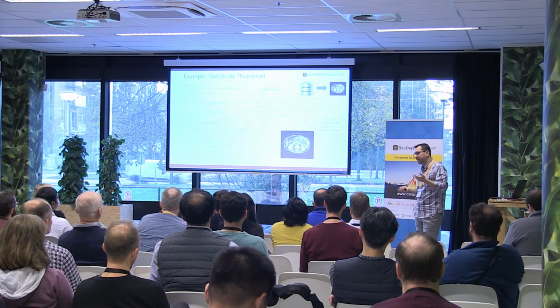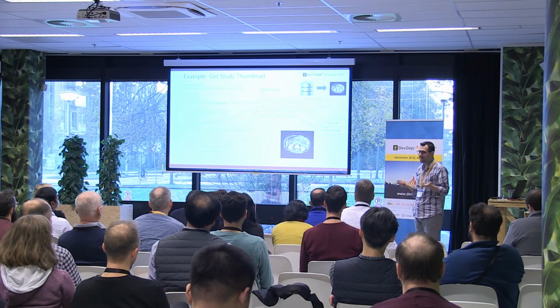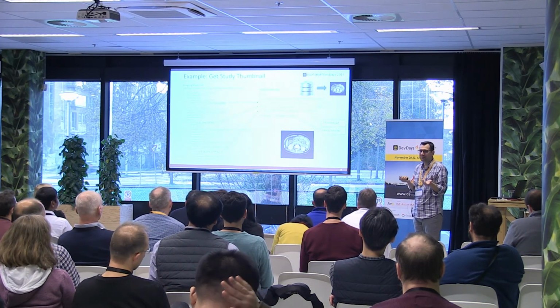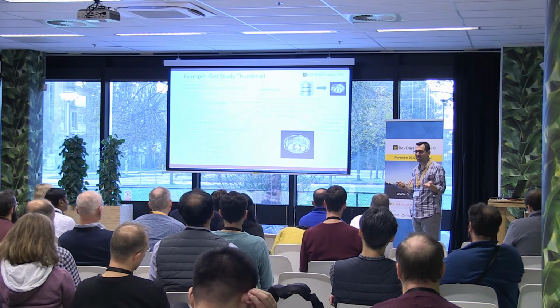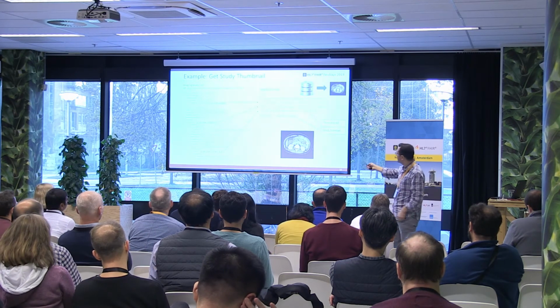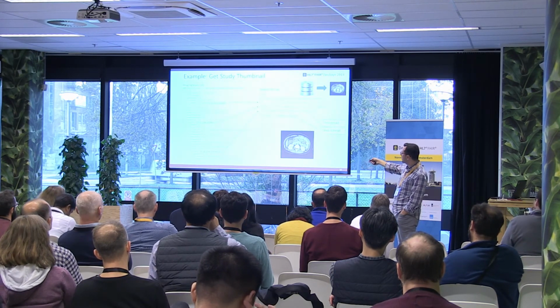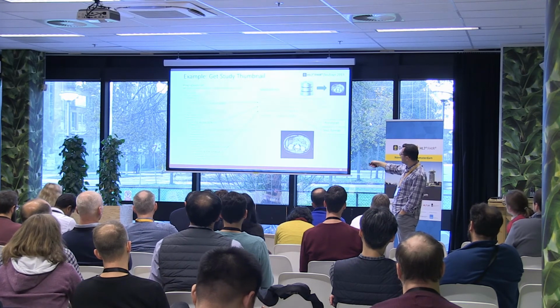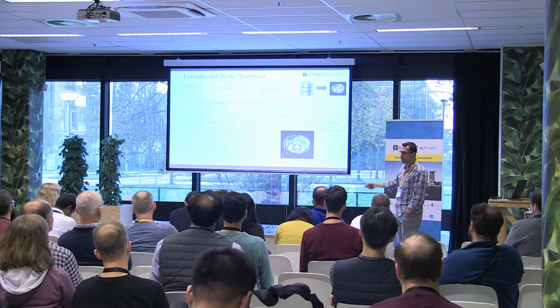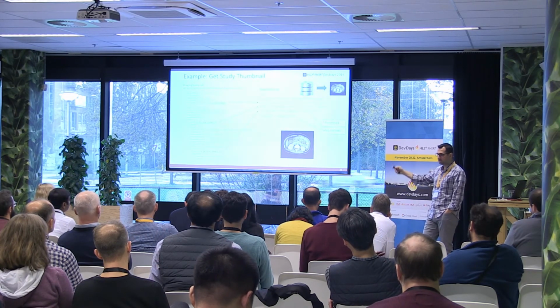There's no real advantage for PNG here over JPEG. They're obviously not transparent. PNG is nicer because it's not compressed, but does it really matter? I don't think so. But anyway, you see this is where these identifiers came from. They all came from the different attributes that we saw here. And if you look at the exercises that I have attached to the session, it goes into this in more detail.